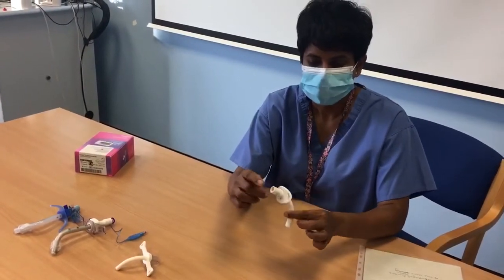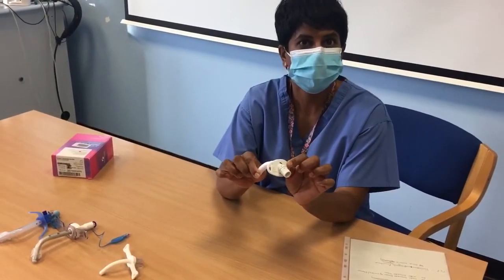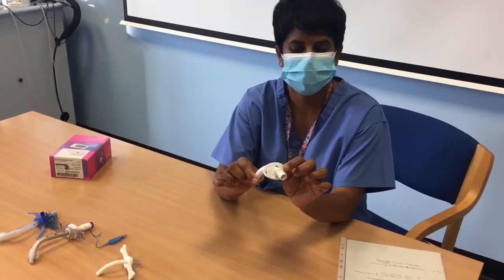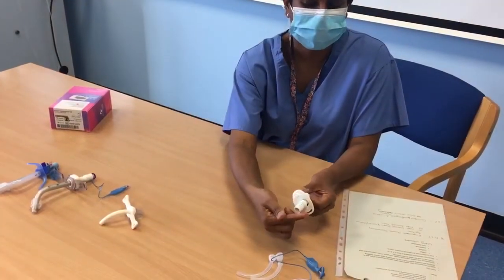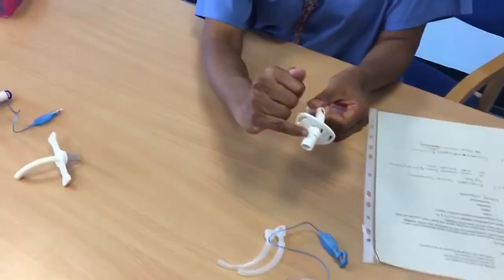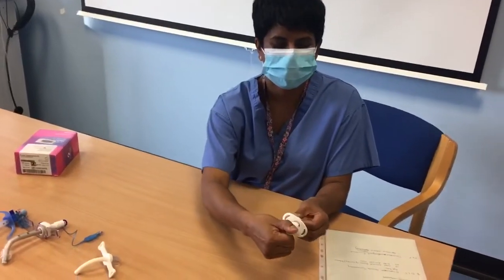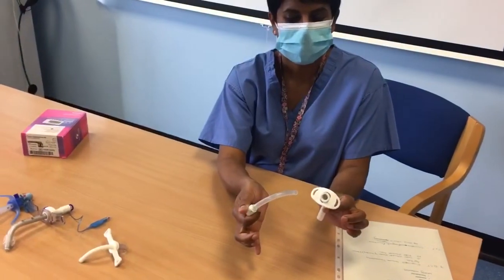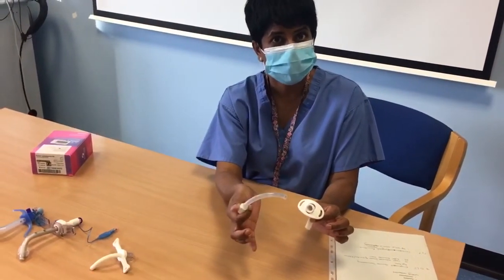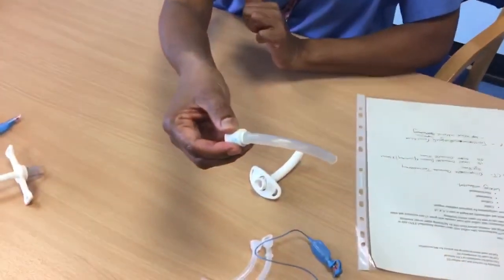Again, the size of the tracheostomy tube is written on the tracheostomy itself, easily identifiable. There's an inner tube also, and it has a locking mechanism, so the two dots there need to be aligned to ensure security. So I'm just going to unscrew it here and take it out. So that's our inner tube. Now that's going to allow us to suction our patient, and you'll notice that on our inner tube there is no fenestration, there's no hole.